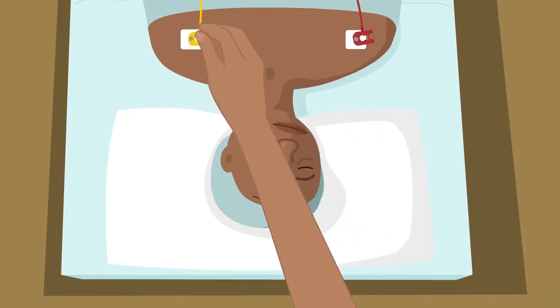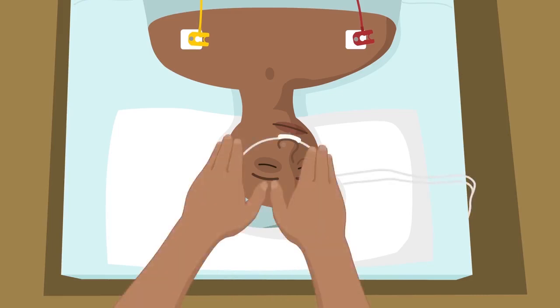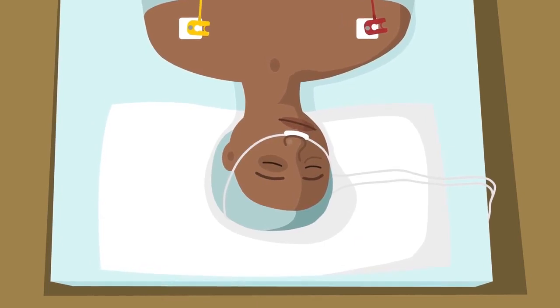The patient's hair must be entirely covered by a cap. To avoid any risk of contamination, the insertion site must be completely free of hair or electrodes. Oxygen delivery devices are applied. The site must be clean; if not, visible soiling is removed with soap and water and the skin dried. The head of the patient is turned away from the insertion site. Adjust bed elevation to the height of the operator for ergonomic working and put the patient in the Trendelenburg position.